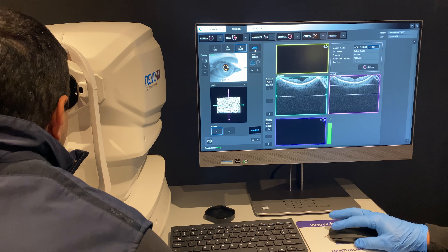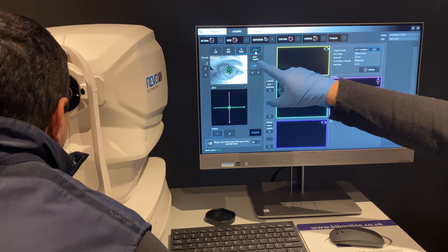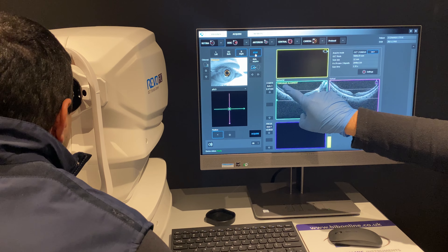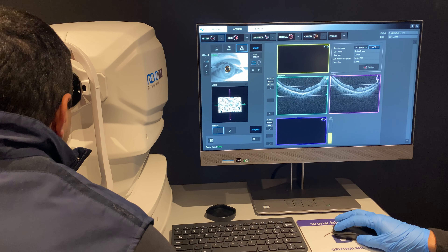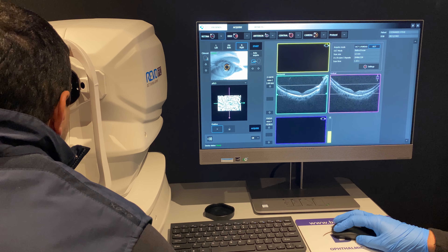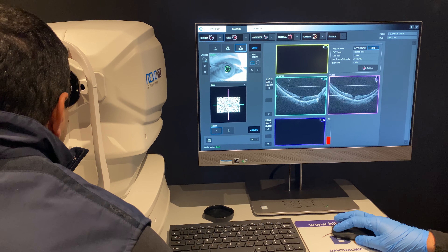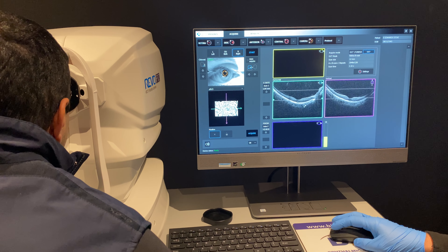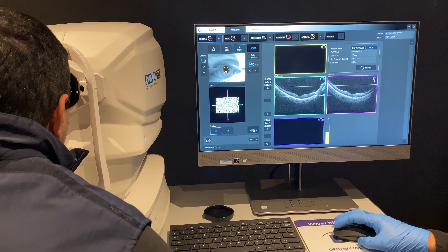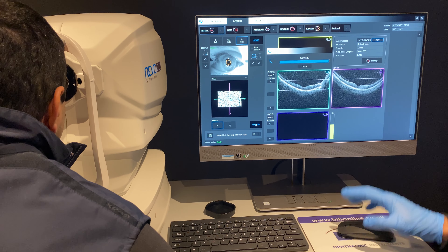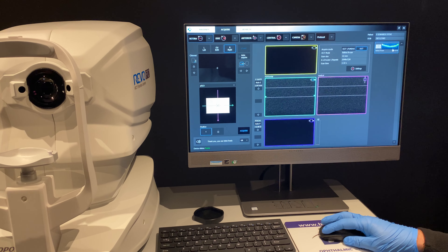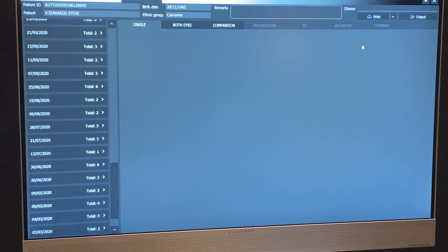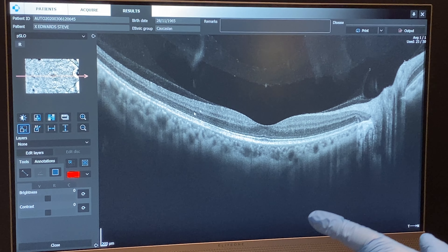I'm going to press start at the top. There's no voice prompt now because I'm in semi-auto mode, so I'm going to talk the patient through the scan. I'll wait for the retina to appear and for 'ready' to appear in this top corner. When it does, I can grab the patient's retina and drag it down, and I can rotate. Can you give me three blinks and then keep your eyes nice and wide, looking at the cross? Done — you can blink, sit back and relax.